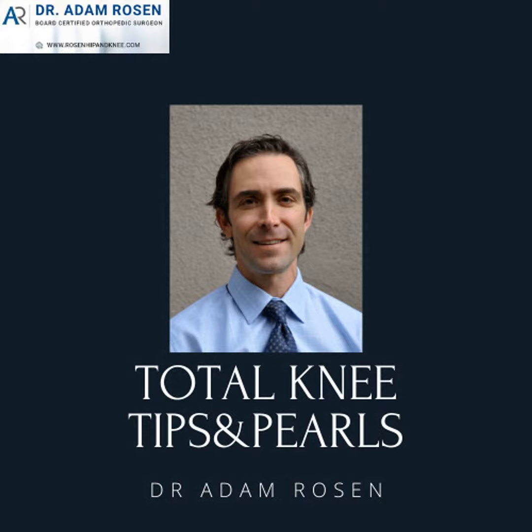The next thing, which again you may gloss over, but you need to put into your brain as part of the algorithm, is to look at the soft tissue. You might look at the soft tissue and it looks fine, so you just skip ahead and say the soft tissues look normal. But you might say there's a foreign body, there's a mass, there's air in the soft tissue. This patient is of large body habitus based on the soft tissue envelope that you can see. Those are all important things to incorporate. And notice we haven't even gotten into actually looking at the bones.